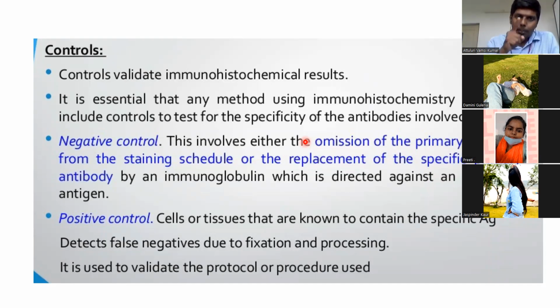Upon performing immunohistochemistry stainings, we must do counterstaining on the same tissue. Counterstaining must be done with the help of hematoxylin and eosin. Counterstaining will give the background, so the entire tissue will be visualized. In that entire tissue, we can now see the special color. Our immunostained color can be seen. Okay, so counterstaining with H&E is very important.